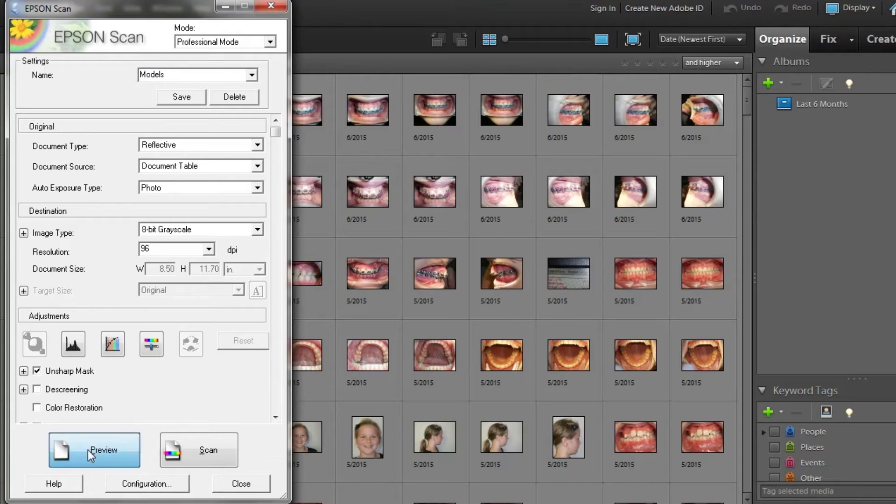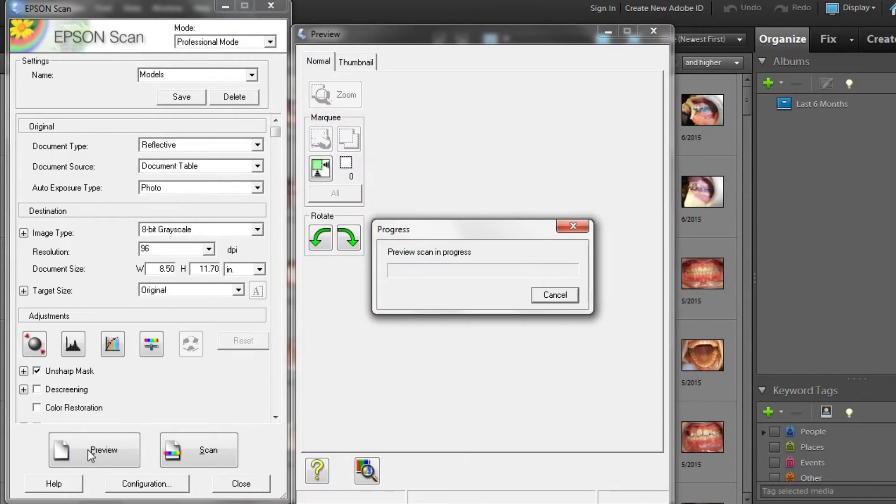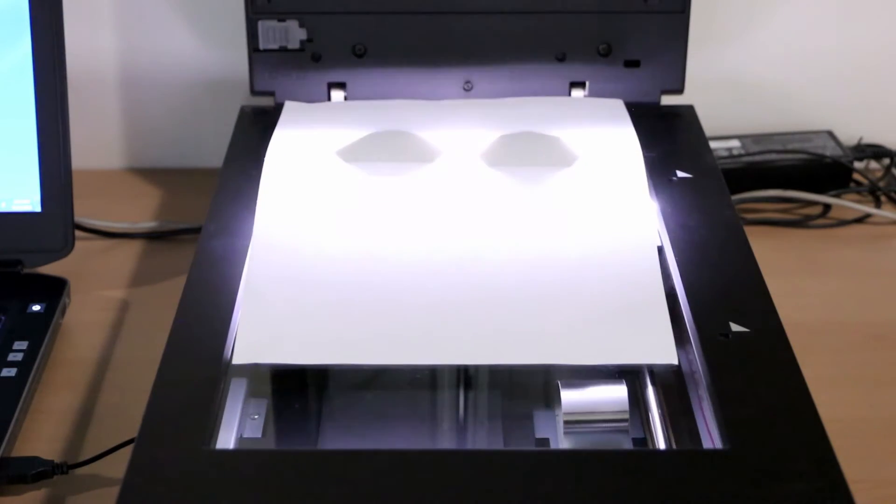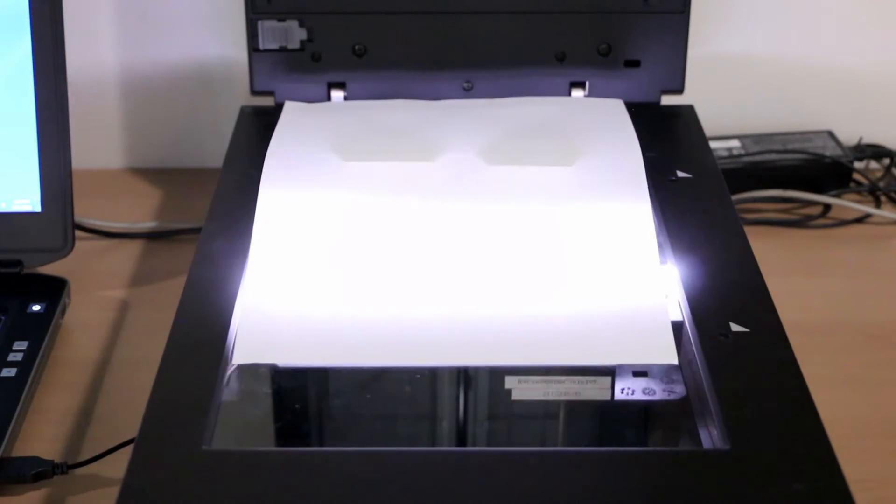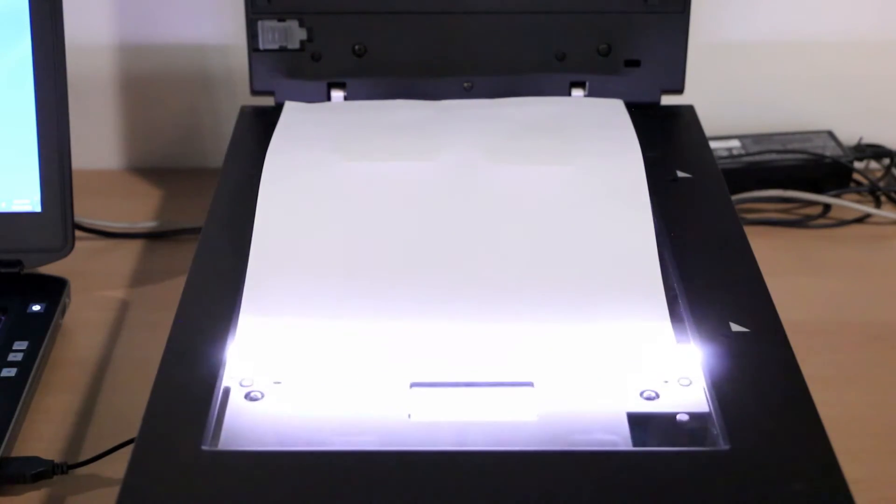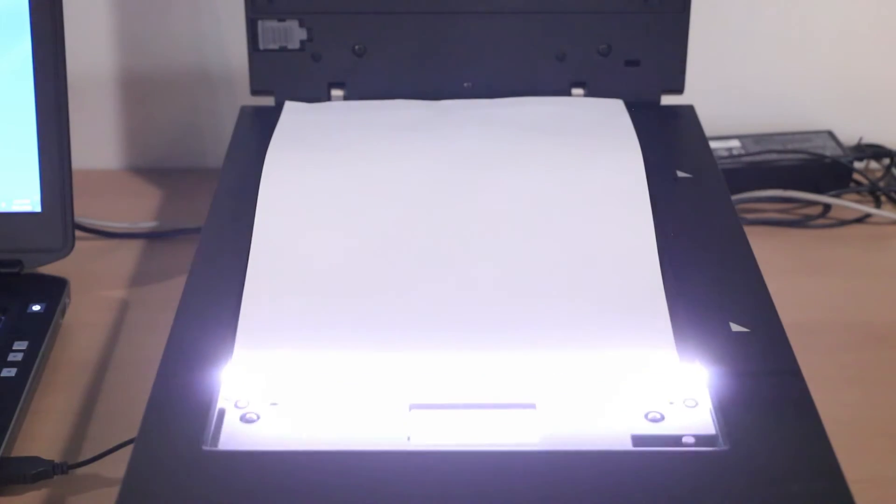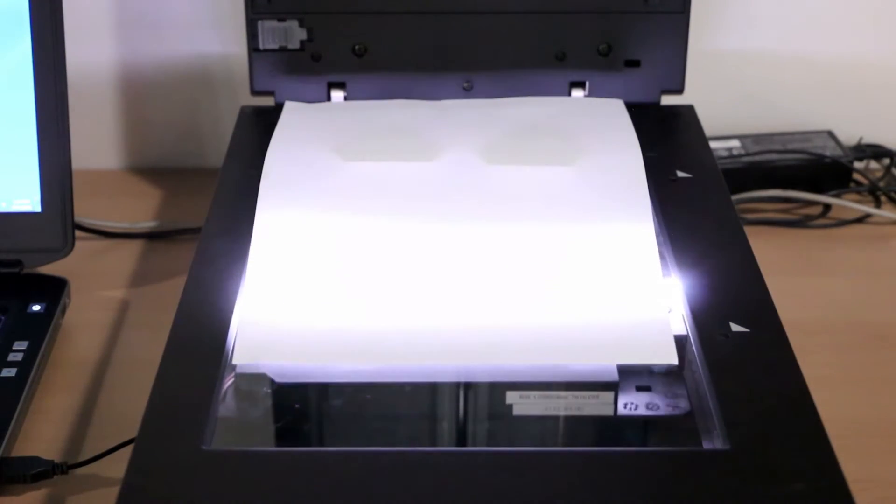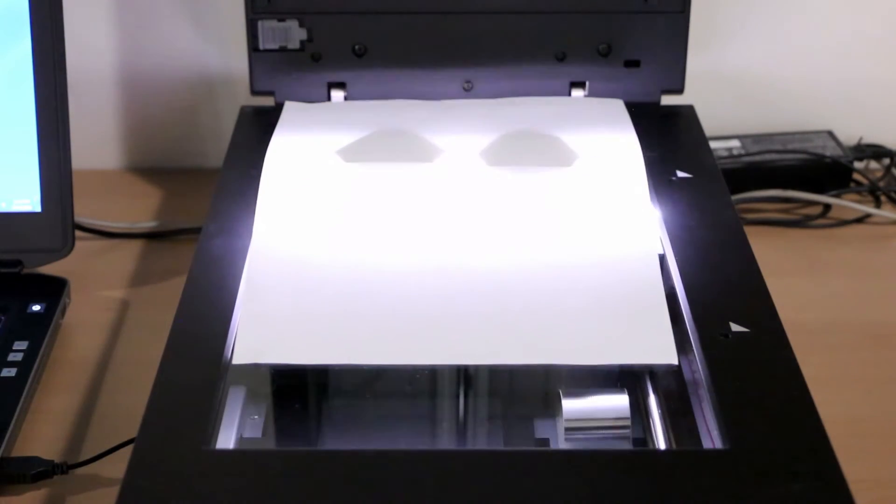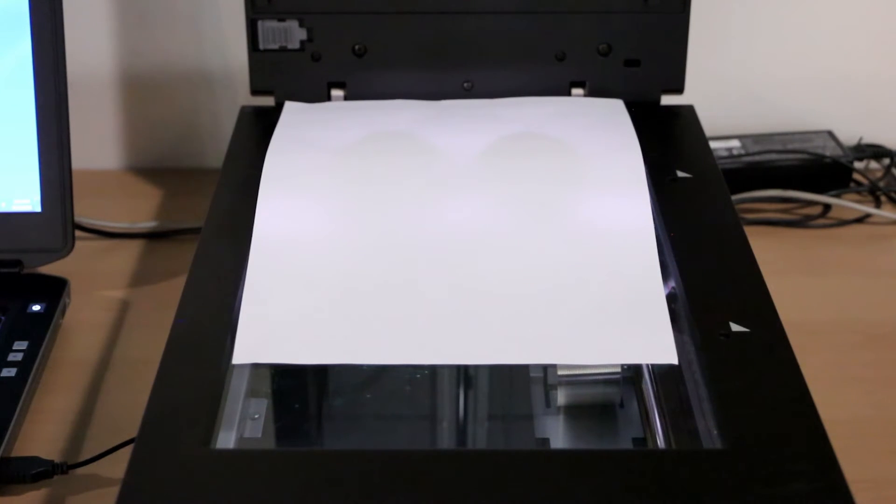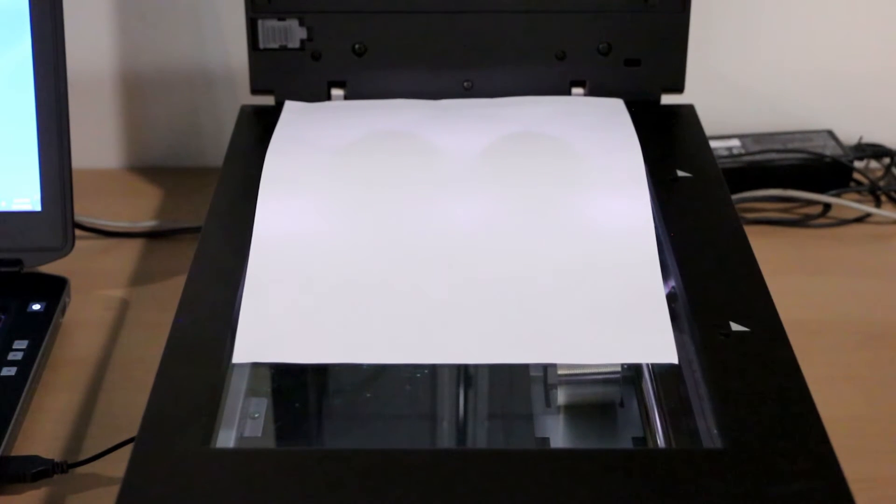Select Preview. Make any adjustments to be sure the arches are well aligned and parallel, and Preview again if necessary.